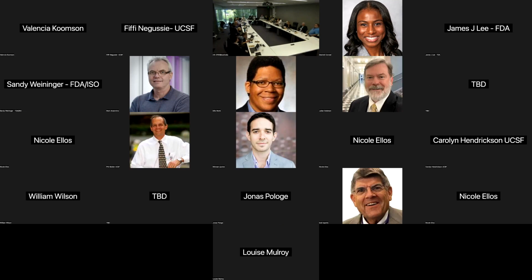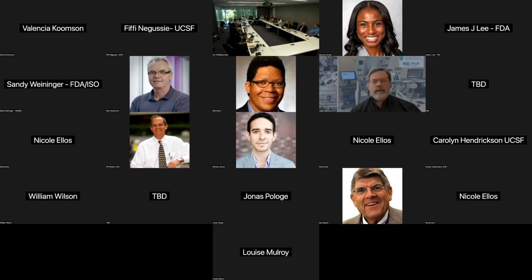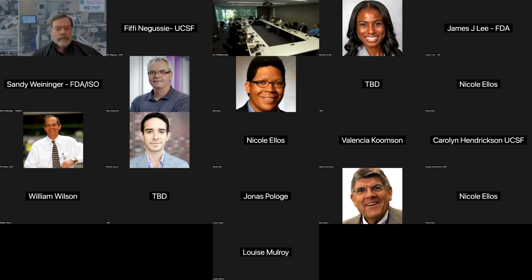Caroline? Yes. In addition to the way the machine is reporting information or uncertainty, Phil, you brought up a really good point, which is that our clinician colleagues, if they're getting two different values from two different sites, want to believe the higher one because we're often trained to think that the lower one is a bad reading and therefore less accurate.